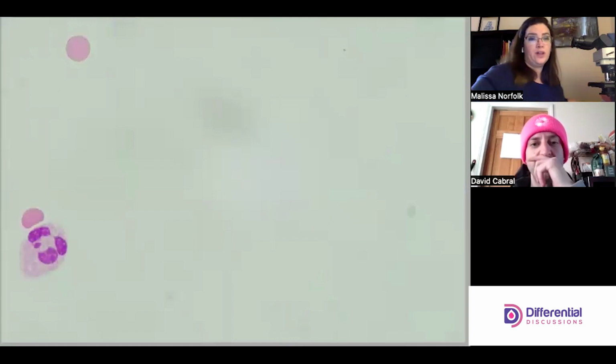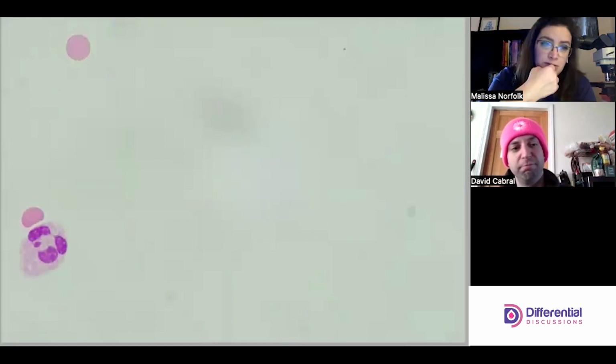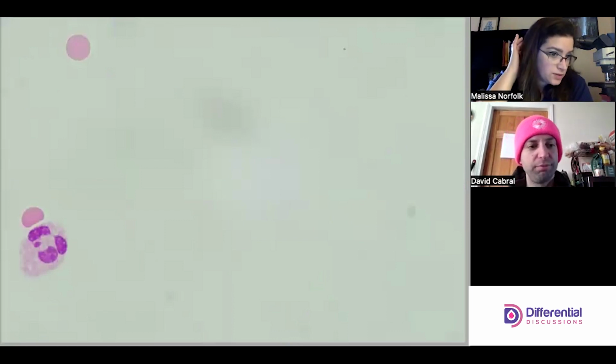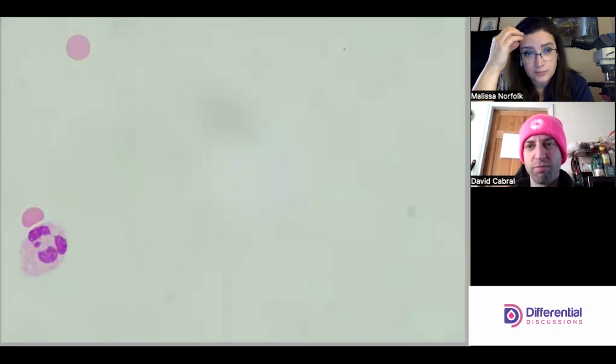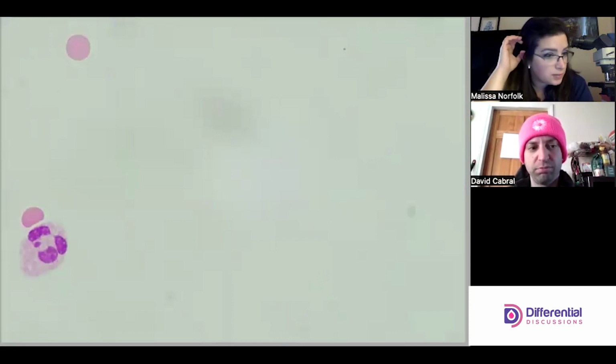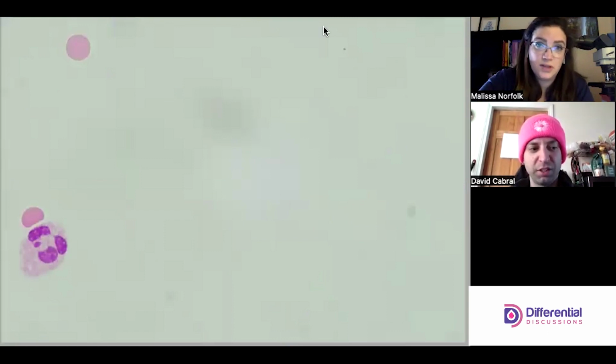I don't see a whole heck of a lot in this one. This one looks pretty clear cut so far. I think it's mostly just neutrophils. I don't see any bacteria. Couple of lymphs, couple of monos. Nothing exciting, easy peasy. Send it out.